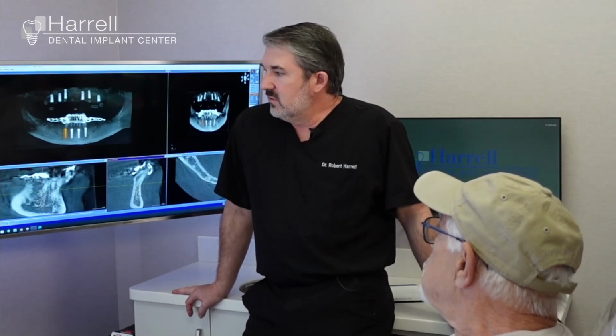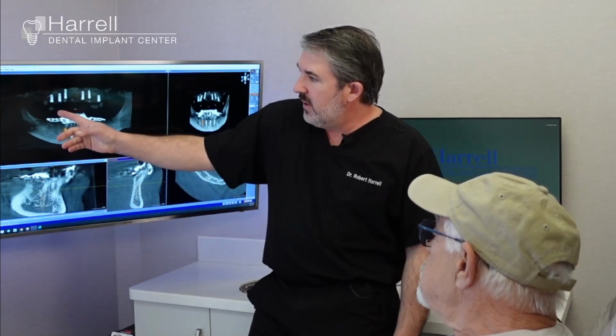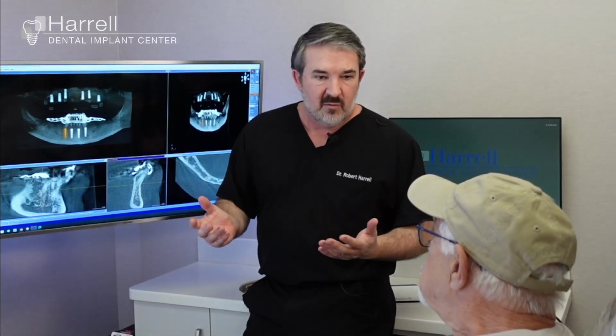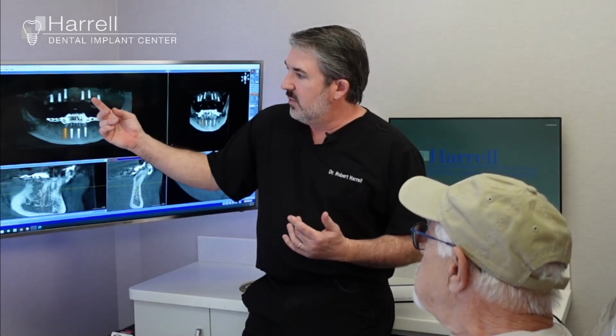A lot of variables can make it faster or slower. Right, I get it. Yours looks to be pretty straightforward. We've got planned on your scan. We can see bone densities look good. You've got enough volume of bone. We're looking at height, width, and density to make sure that we've got room for some substantial implants.